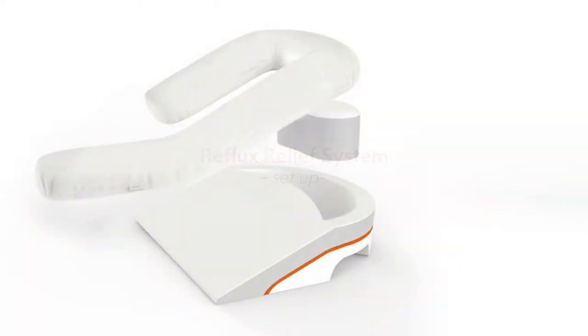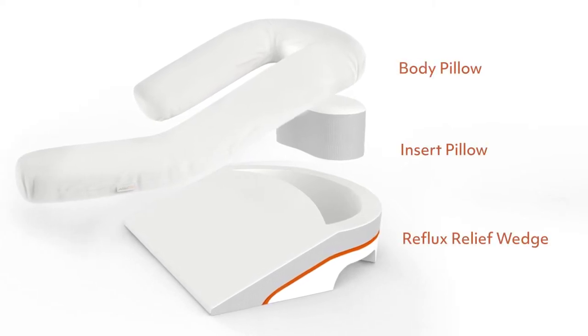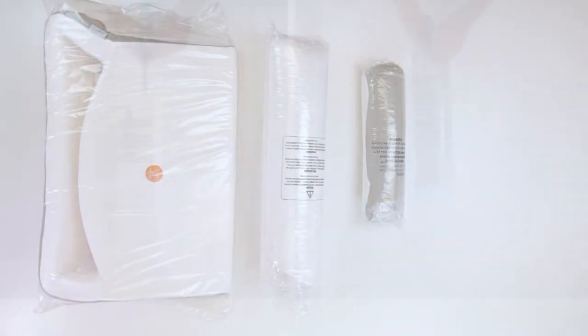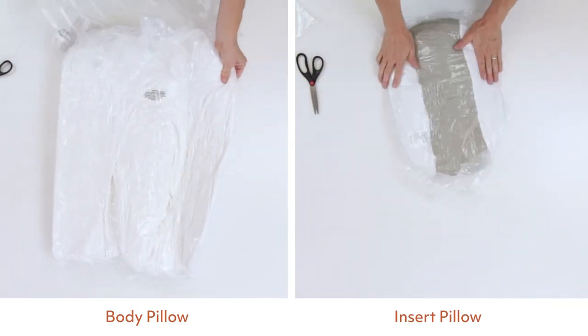Your MedCline reflux relief system includes three separate pieces: a reflux relief wedge, an insert pillow, and a wrap-around body pillow. Remove each of these items from the box and carefully remove the plastic shrink wrap. We recommend letting each piece air out for a couple of hours to breathe and fully recover from compression.